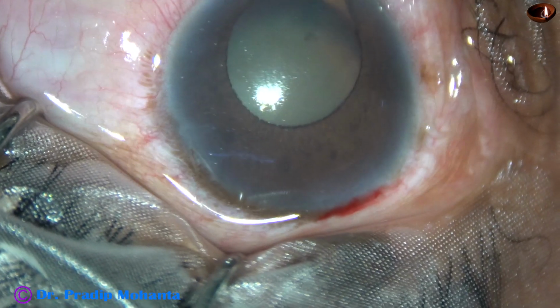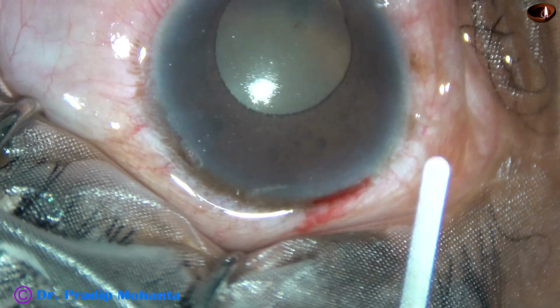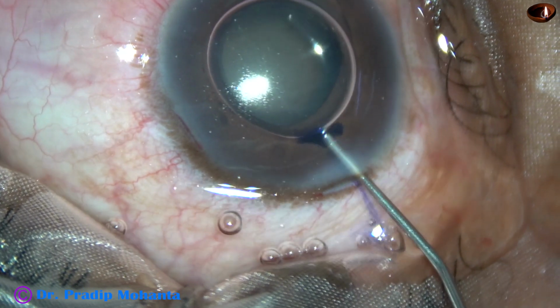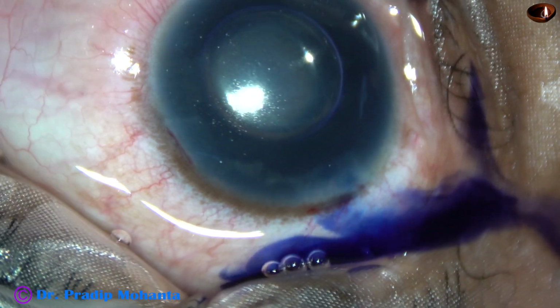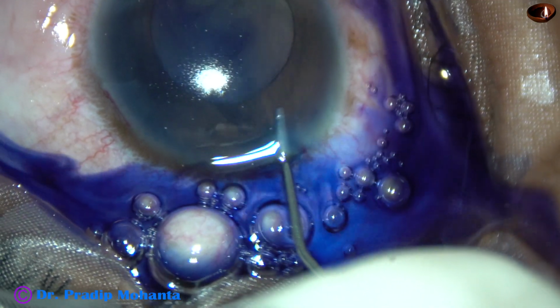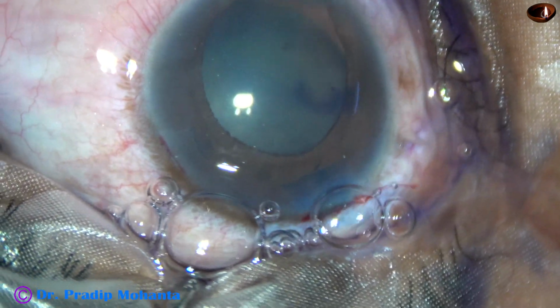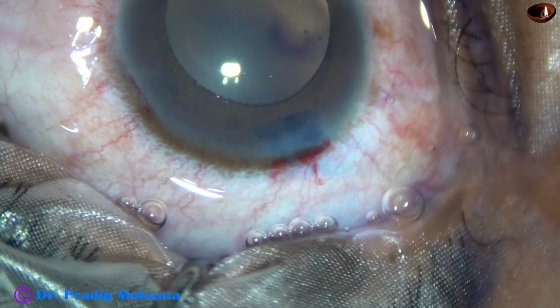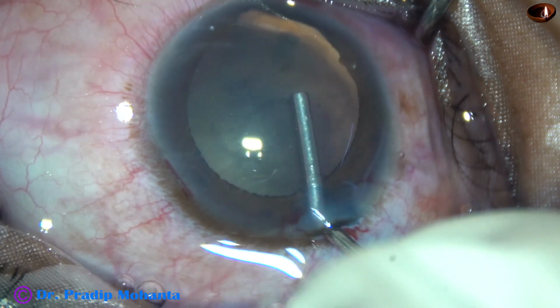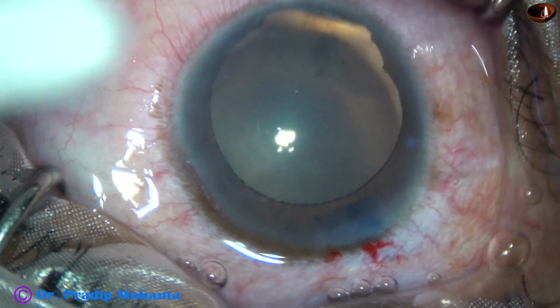And now an air bubble is injected into the anterior chamber. You can see that the pupil has not dilated well. So my plan is to inject the dye and a bit of adrenaline to see if the pupil dilates. Otherwise, my plan is to use iris hooks. But as soon as I inject adrenaline, the pupil starts dilating. And now see the magic. Within few seconds, this is real time, the pupil dilates to about 6 to 7 millimeter. Very good dilatation in few seconds.